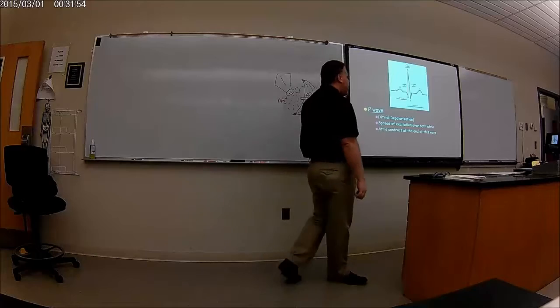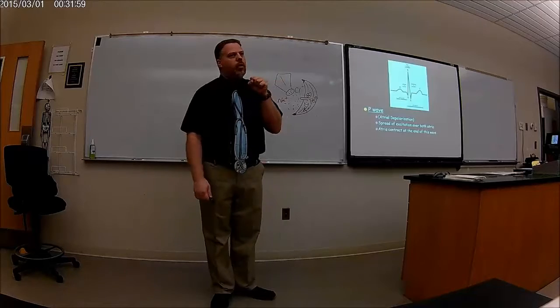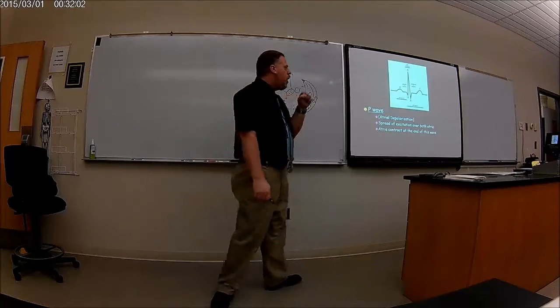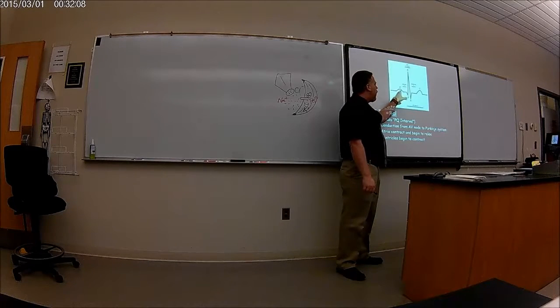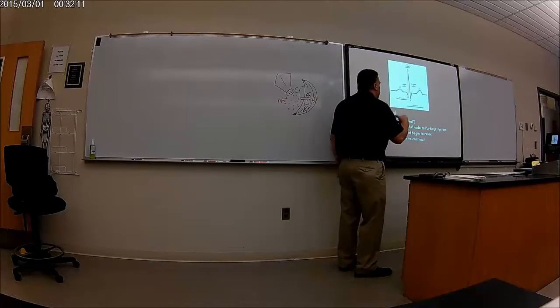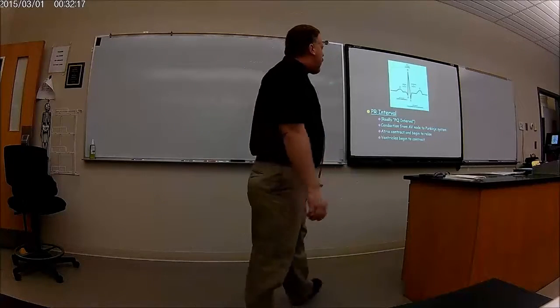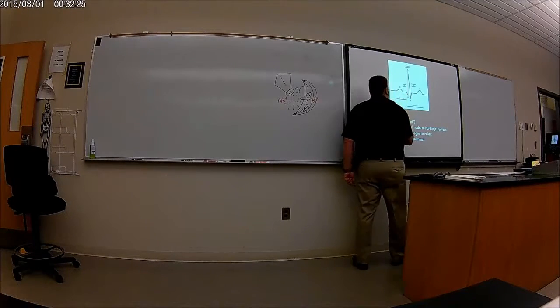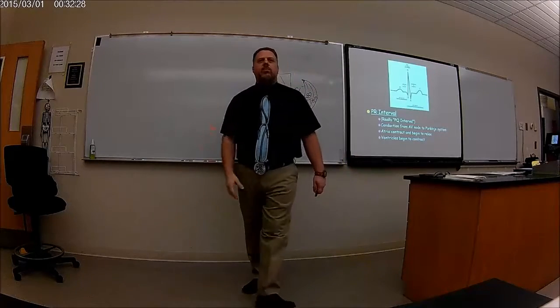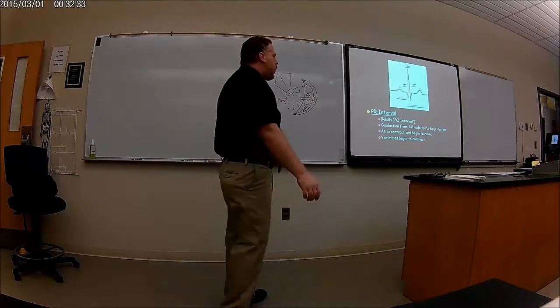Okay? At the end of this P wave, the atria are fully contracted. They didn't relax, it's fully contracted. Then you have the PR interval. Okay? The PR interval from here to here. Now, it's really the PQ interval, and I don't know why they just used it over here. Because this here, we're going to talk about the QRS complex. It's really the P to Q, but they call it the PR interval. You just have to accept it. It's on that list that I have that I'm going to bring up there. All right? You just have to accept it at this point.